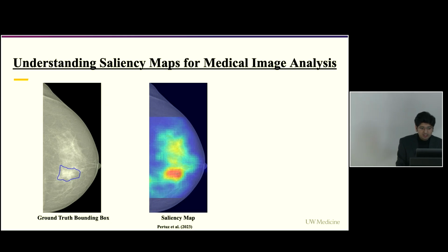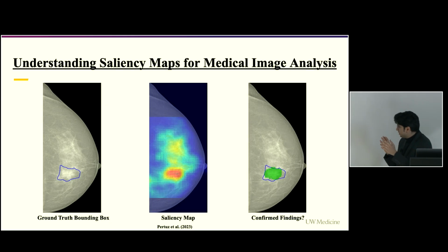And then we can go ahead and confirm whether there is an intersection between the predictions of the model, or its interpretations, and the ground truth findings. And after that, could we potentially say that the model makes sense? And this is not only constant for just mammograms or grayscale images, it is across modalities. For example, whole slide images in histopathology, or MRI scans, microscopy images, CT scans. You can do similar analysis for almost all models, all modalities.